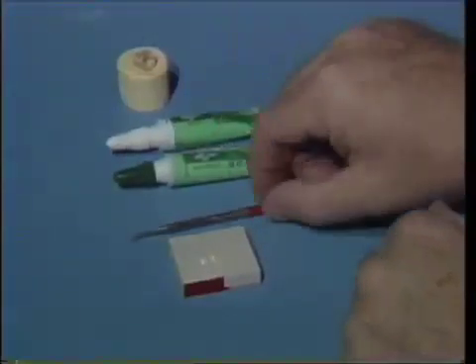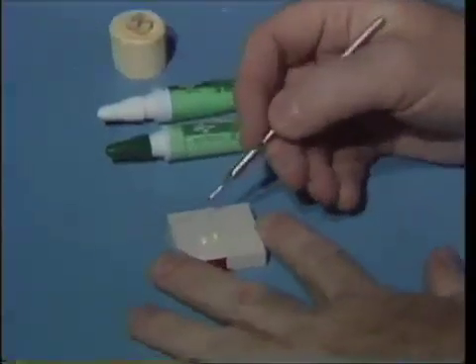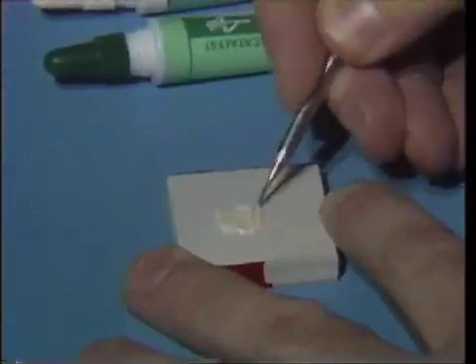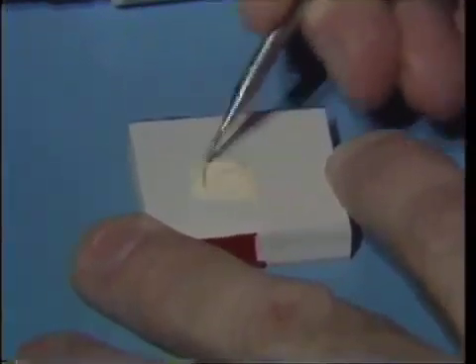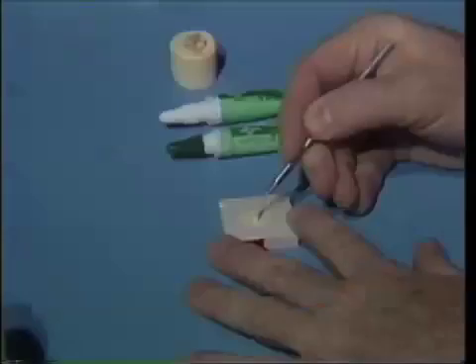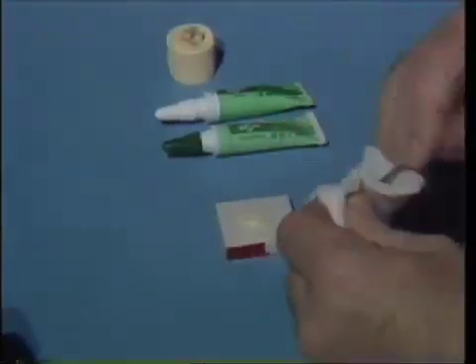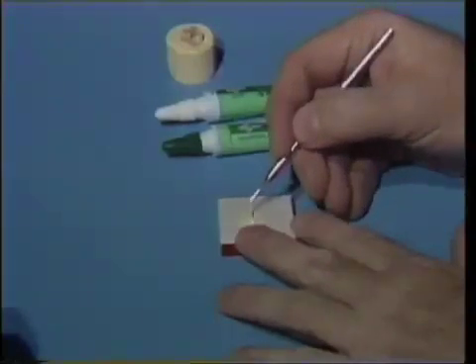After we've dispensed an equal amount, we'll pick up the application instrument and use the long end of the blade to pull the two pastes together and mix them rather quickly so that we get a uniform color as the white and the cream colored pastes are mixed together. Once we have uniform color, we'll take a small piece of gauze square, wipe off the excess, and again pick up just the smallest amount.